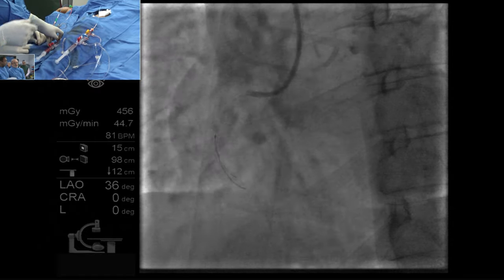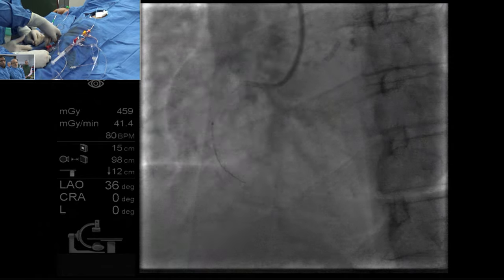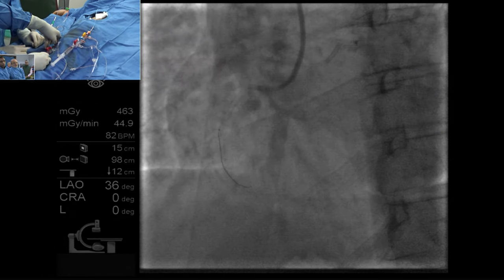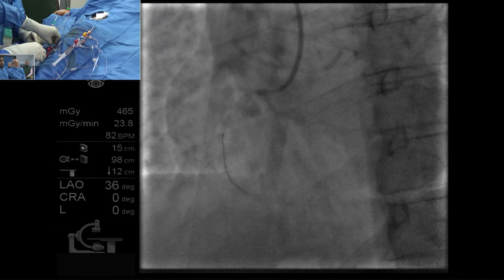We dilate that part? A part we can, but then, you know, it will be a little more. Instead, I like to have a Pilot 150 or a stiffer balloon to penetrate. Let us take a good injection here.